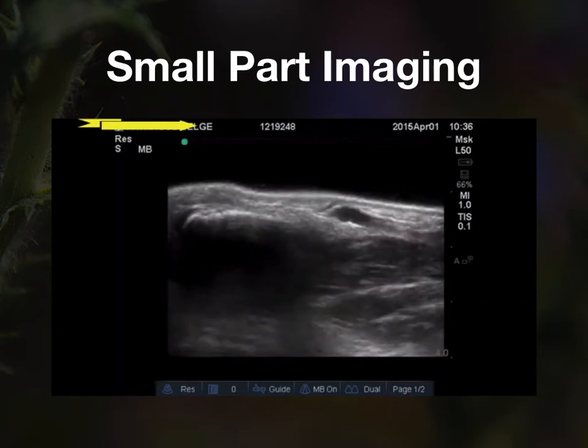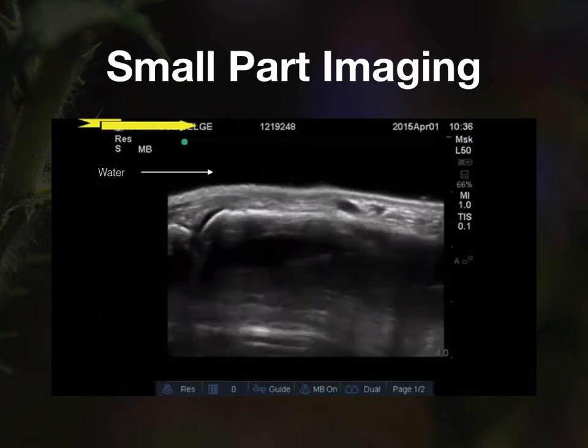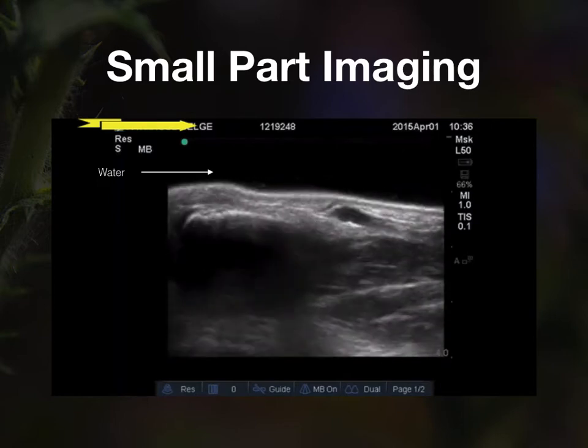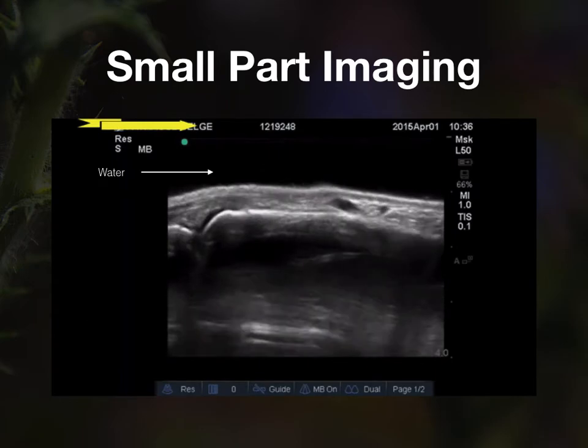Here's an example of a finger submerged in water. Notice you can see the black anechoic water overlying the finger and be able to evaluate underlying structures of the finger, including the cortex, as well as evaluate for fluid in the joint and soft tissue swelling.